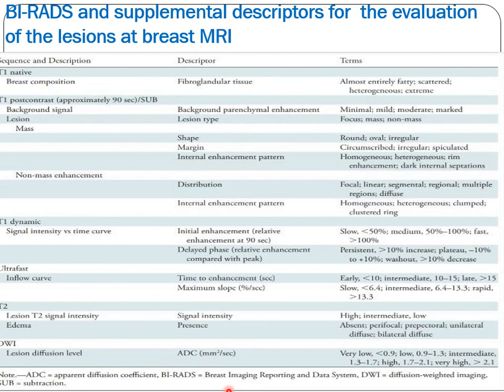Ultra fast, as I told you before in detail, is the inflow curve of the lesion, time to enhancement, and maximum slope. Also early, intermediate, or late takeoff of the enhancement. I talked about this in detail in the first part of our seminar.